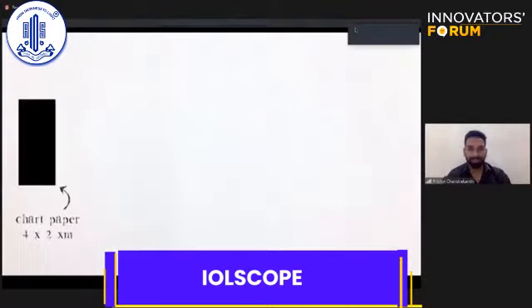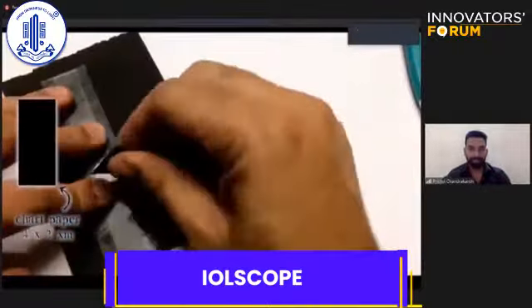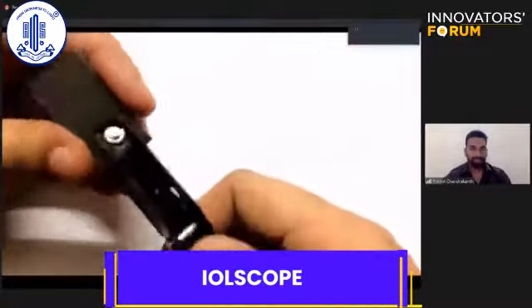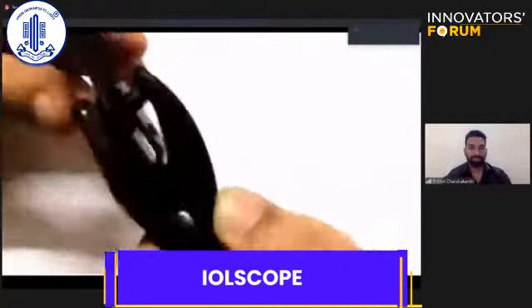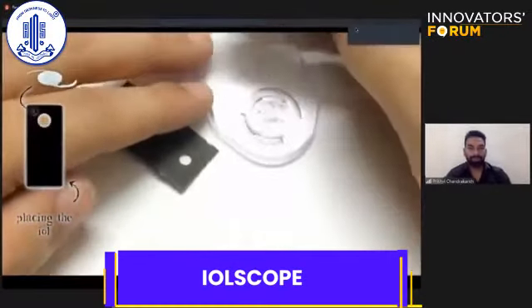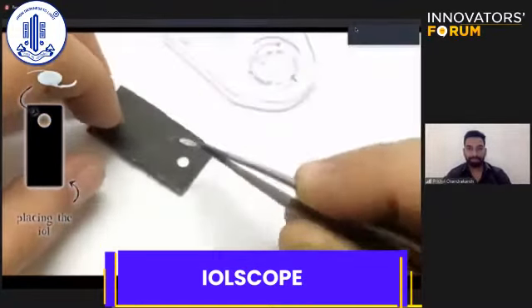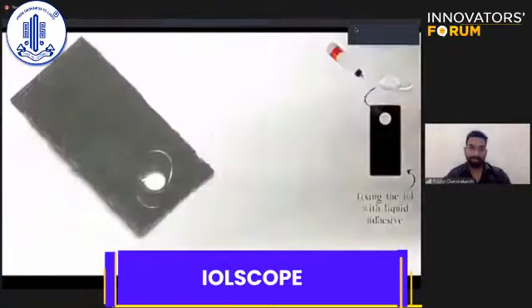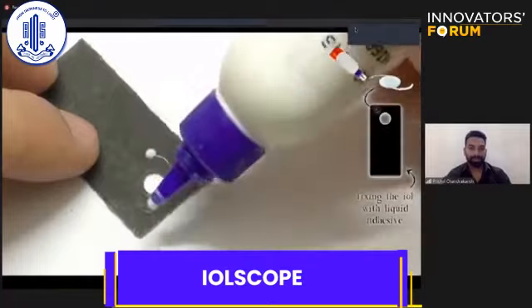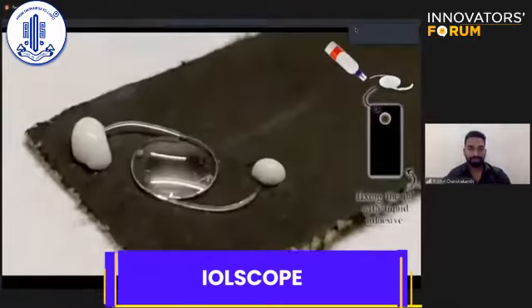How to prepare? Take a chart paper of 4x2 cm, cut it out using a puncher. Make a circular punch on the paper. Take the IOL and place it at the hole created. Using a liquid adhesive, glue it to the chart paper. Let it dry.